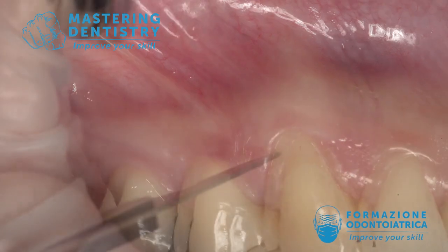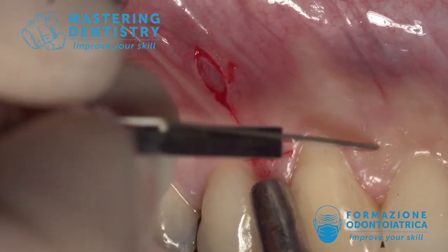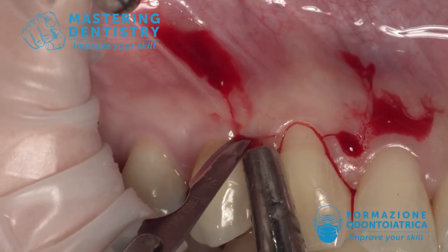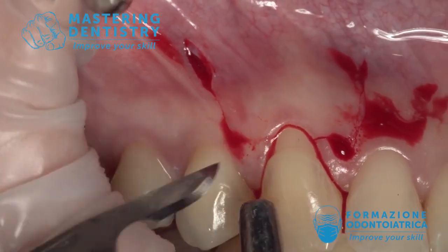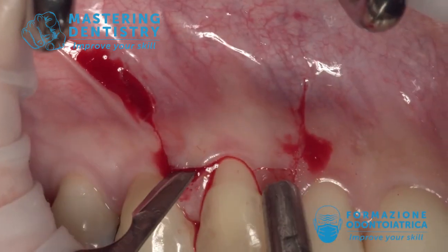Pushing a little bit with the probe on the gingival tissue, you can mark the direction of the incisions. Then we start with the incision: two horizontal incisions three millimeters long, and two vertical incisions going above the mucogingival line for about five to six millimeters.